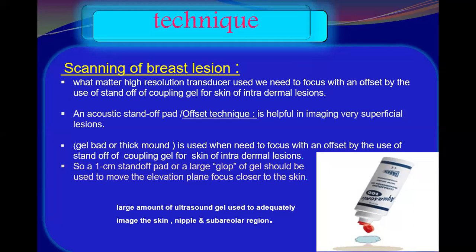That means the narrow zone, yes, it's near, but it's not as near as the level of the skin lesions. If you remember the image, I did not bring it here again.